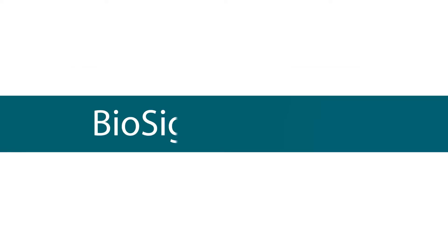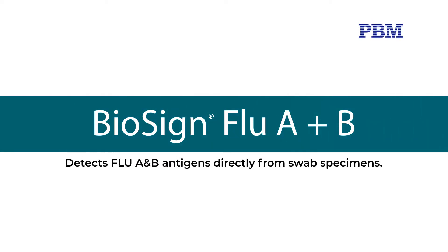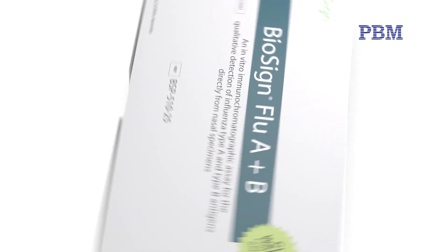The BioSign Influenza A and B test is a CLIA waived rapid qualitative test that detects type A and B antigens directly from nasal swab, nasopharyngeal swab, and nasal wash specimens obtained from patients with signs and symptoms of respiratory infection. This video demonstrates the nasal swab and nasopharyngeal specimen test procedure.